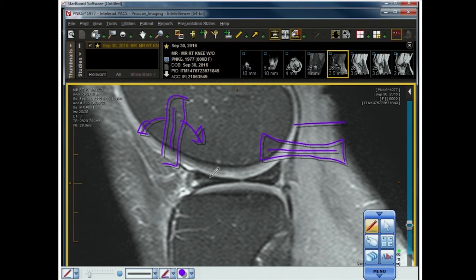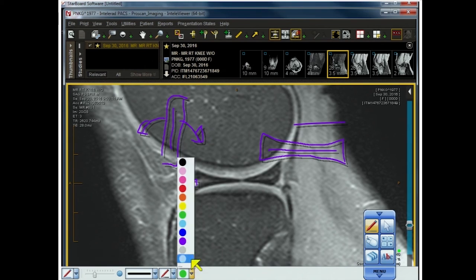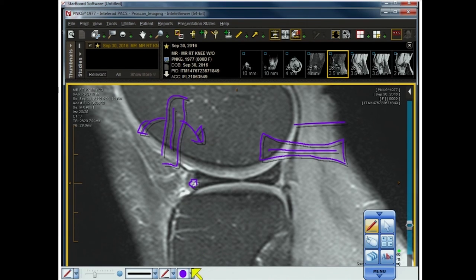Let's talk about what's happening in the front. In the front we've got this little tiny round globular thing, which is a meniscal pseudocyst. Why is it a pseudocyst? Because it's not lined by epithelium or synovium — it's lined by fibrous tissue, as opposed to a true cyst which is epithelial-lined. So we say there's a perimeniscal small pseudocyst of meniscal origin, about four by three millimeters in size. Sometimes you'll get them within the meniscus — that's okay, just describe it. When they're really big and outside the meniscus, you may have to fix it from the outside and inside.